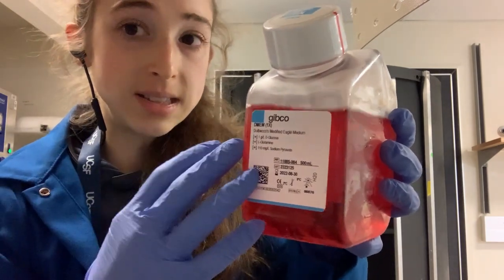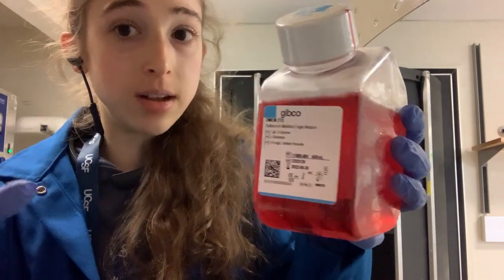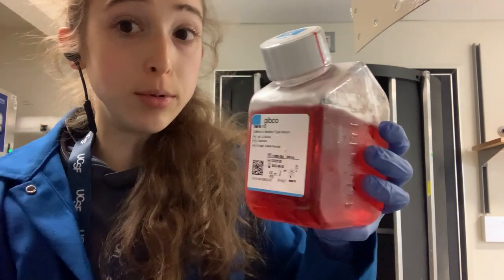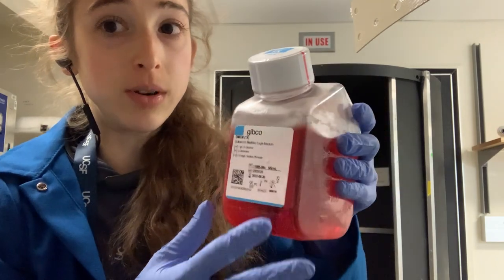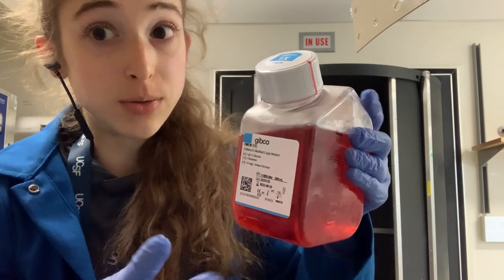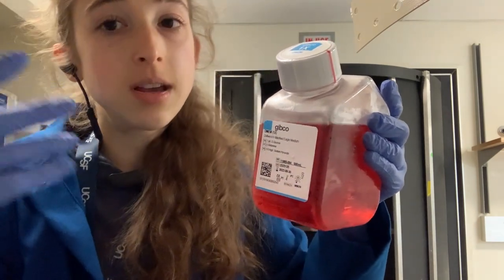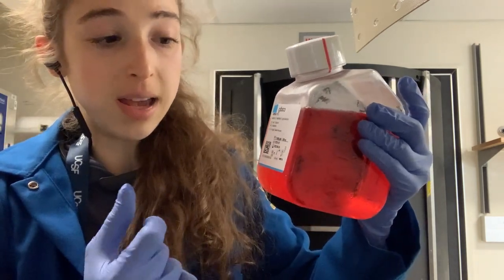We'll add the FBS to this. Some people also add antibiotics, although that's not typically recommended anymore. Traditionally people would add pen-strep — penicillin and streptomycin — but people are trying to move away from that. If you have a sterile culture, you shouldn't have to worry about bacteria. And if there are bacteria, you want to know about it. Also, antibiotics can be doing things to your cells, and antibiotic resistance is a huge problem, so we don't want to contribute to it by adding selective pressures.